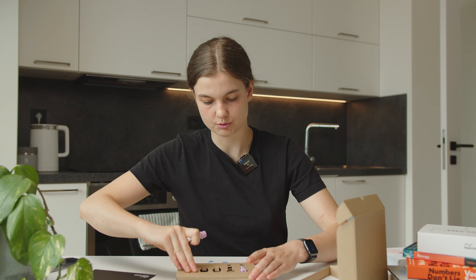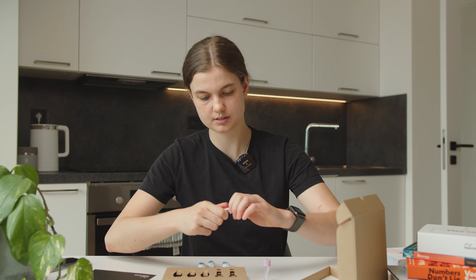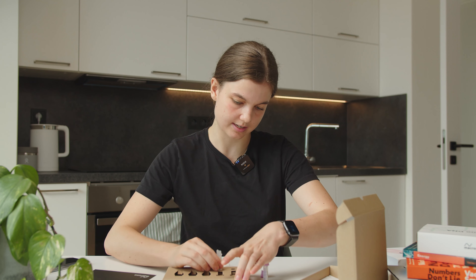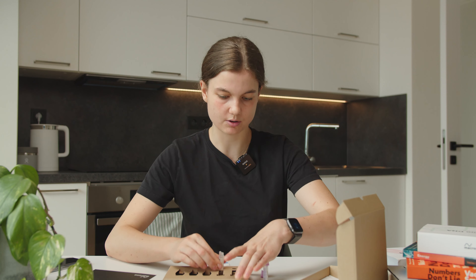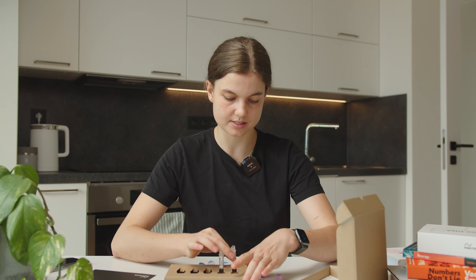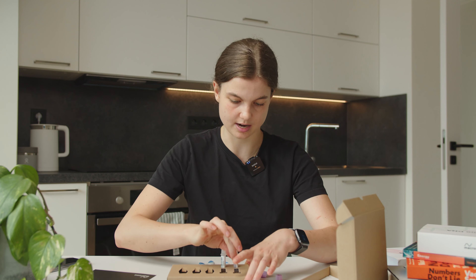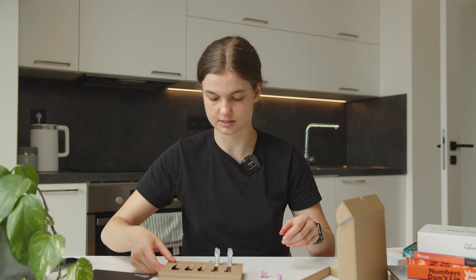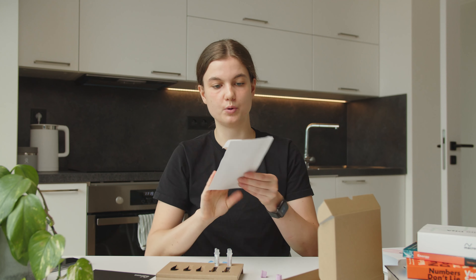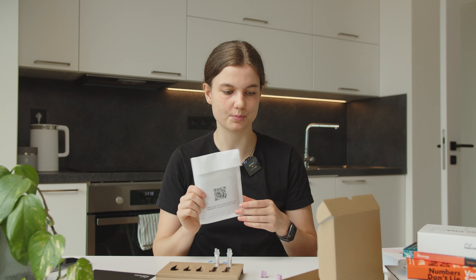What I like to do is place my two tubes upright using the little holders in the cardboard. This way I won't spill them — trust me, I'm the most clumsy person ever. So now they're nice and secure. We also have the prepaid shipping envelope with the logistics.